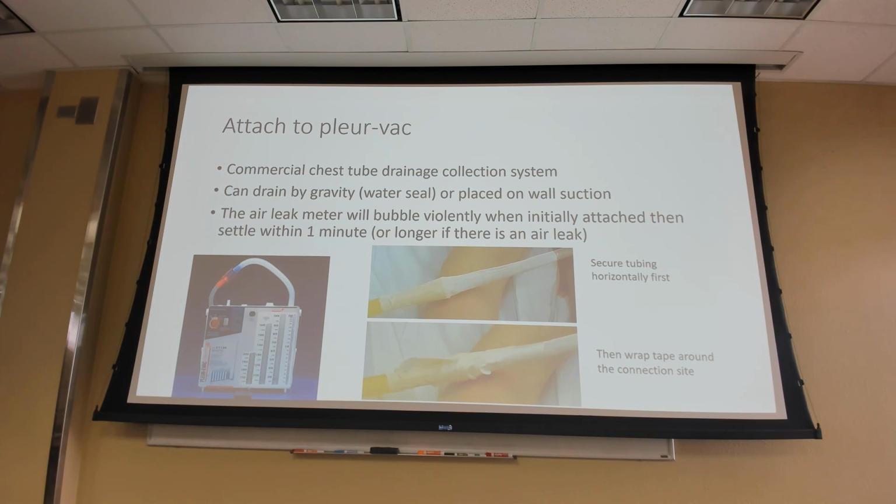And we'll talk about some techniques here. If you have that consistent leak, an easy way... Since you have all that tape on there, you've taken all that time to place that chest tube in there, and it looks very pretty afterwards, you usually don't want to take all that down and check whether you're in the thoracic cavity. Now, the chest x-ray is very helpful. You can see your fenestrations going into the pleural cavity. However, another technique is you can clamp that tube, and that will help you check the water seal.